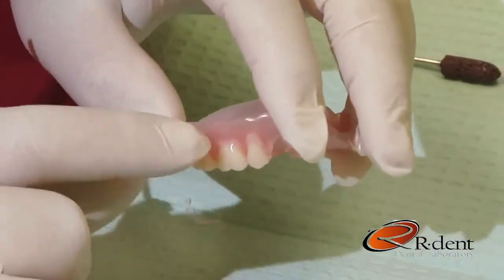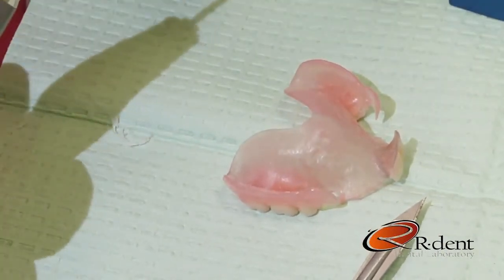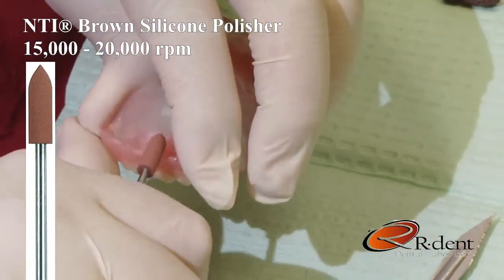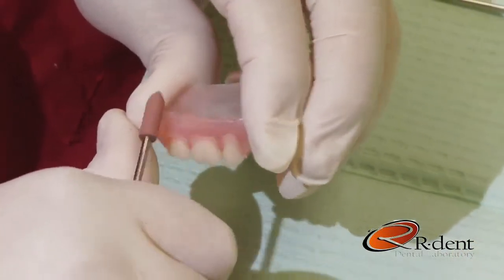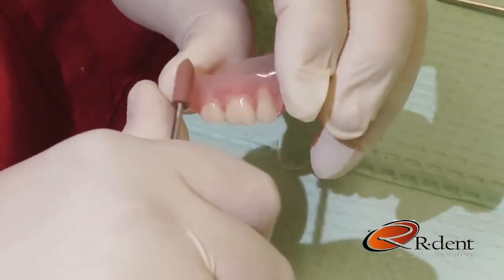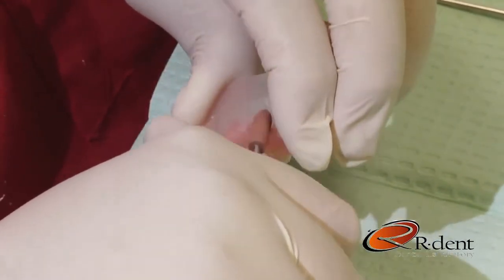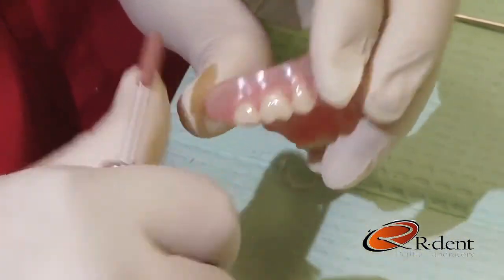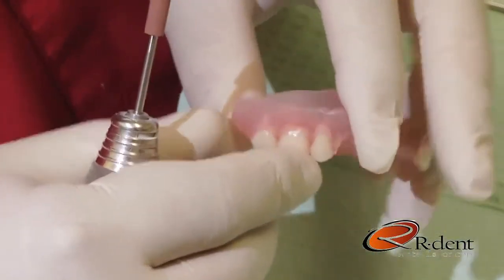Once you've got the periphery surface smooth, we then begin to complete the polish with the brown silicone polisher. At approximately 15 to 20,000 RPMs in a left-to-right motion, I'm making constant contact with the periphery surface of the partial with the polisher, and as you can see, it really brings the partial back to its original shine.